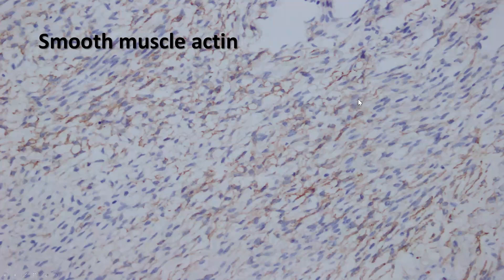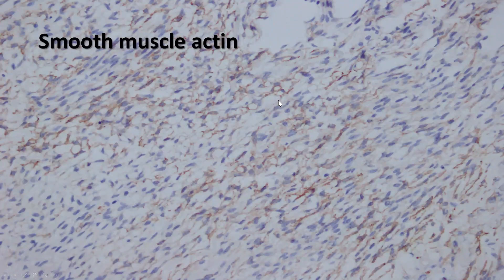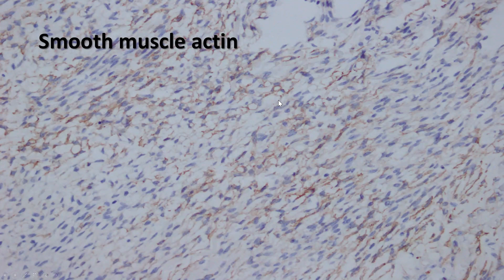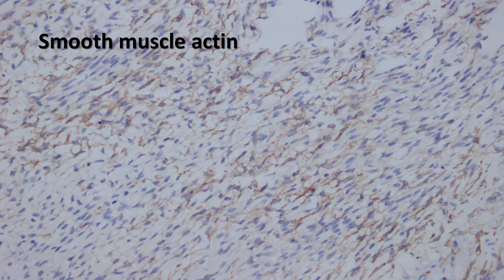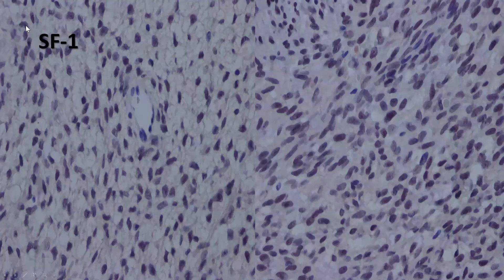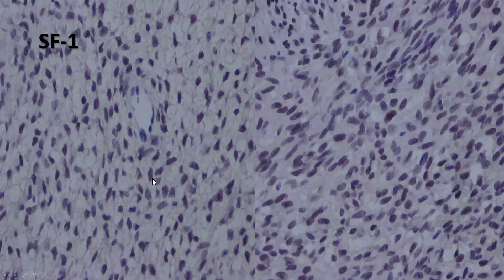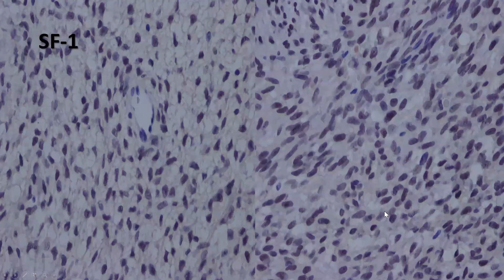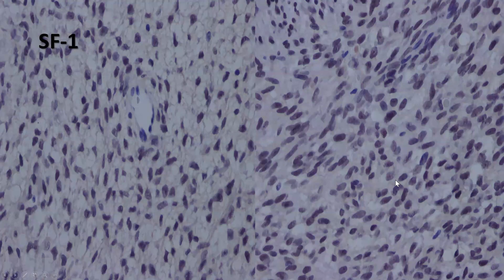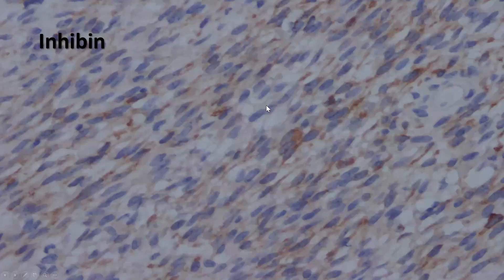Smooth muscle actin tends also to be positive in both components — the fibrothecomatous and the signet ring-appearing cells. In this example, however, the positivity was not particularly strong.